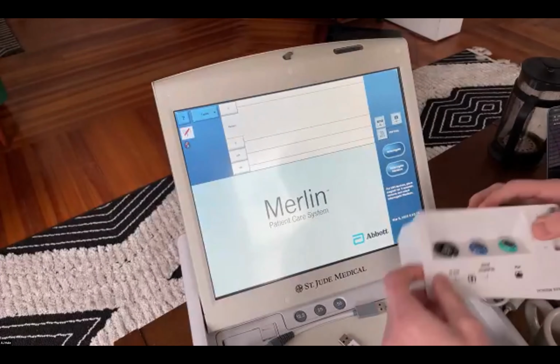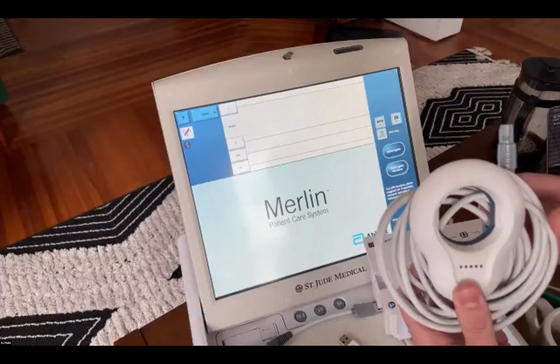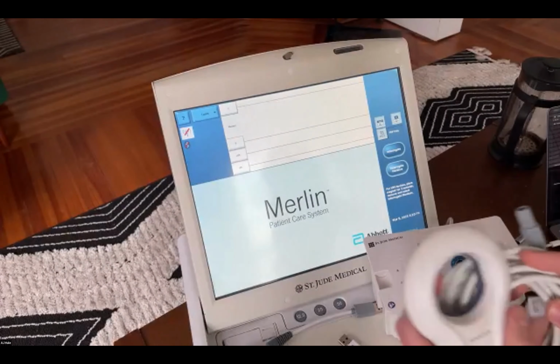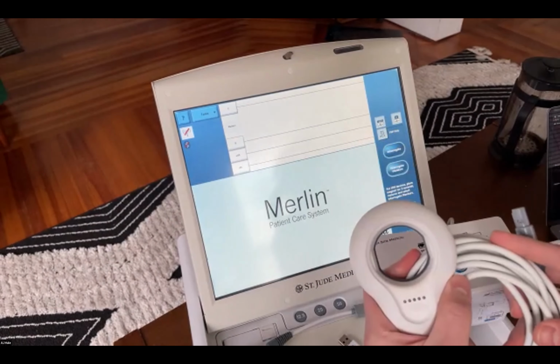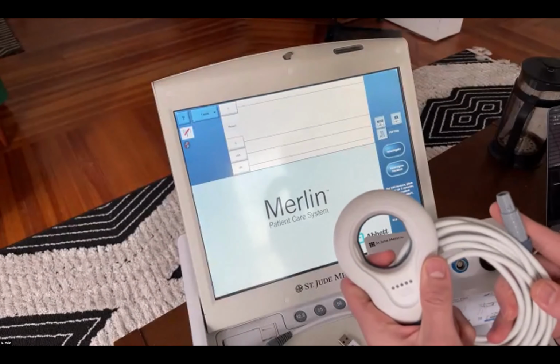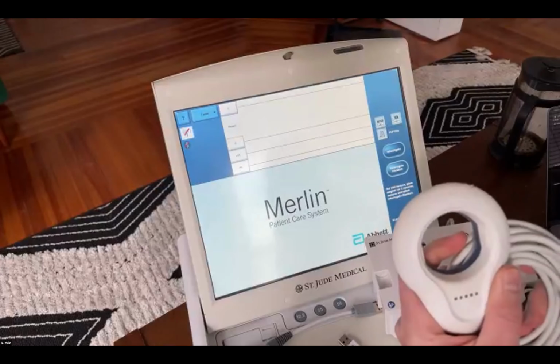So if you have your PSA hooked up in the back, you have your standard wands. This will be your induction wand. This is similar to what you'll see in Medtronic and Boston devices, which we will have somebody go through a programmer tutorial for at a different time. But this is actually how we communicate through inductive telemetry with the device. All of the devices, for the most part on the market, have inductive capability, except for the Confirm RX and Jot DX loop recorders. The rest all use induction to communicate if you need to.